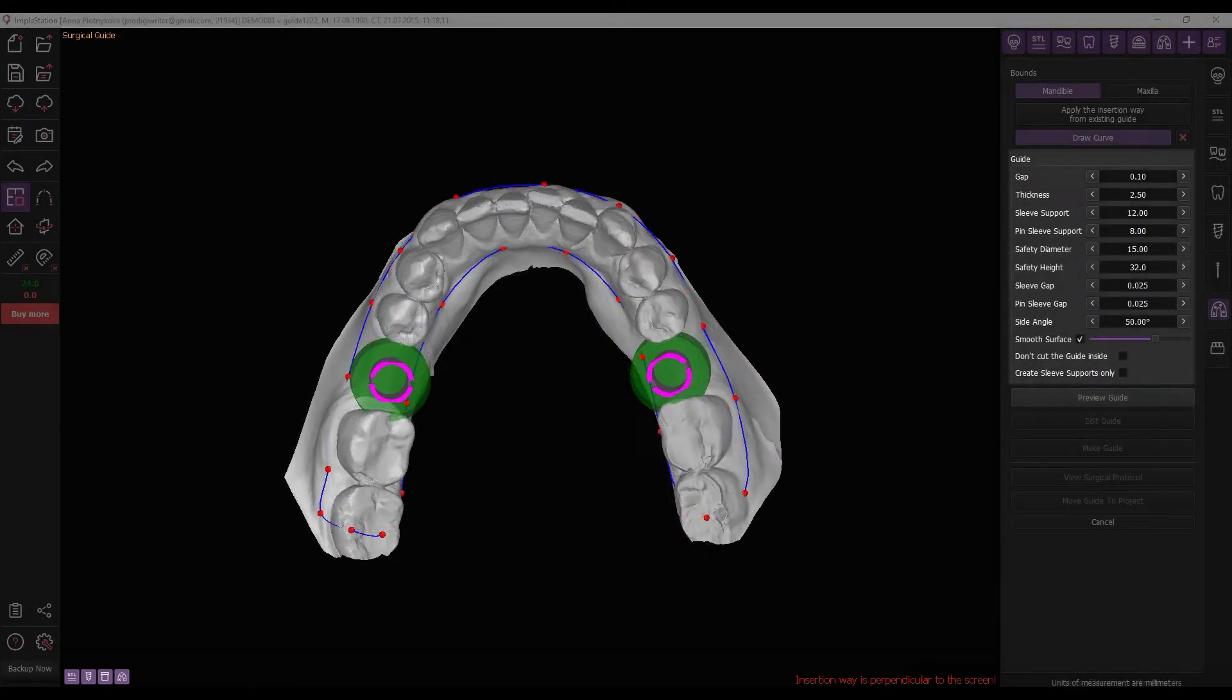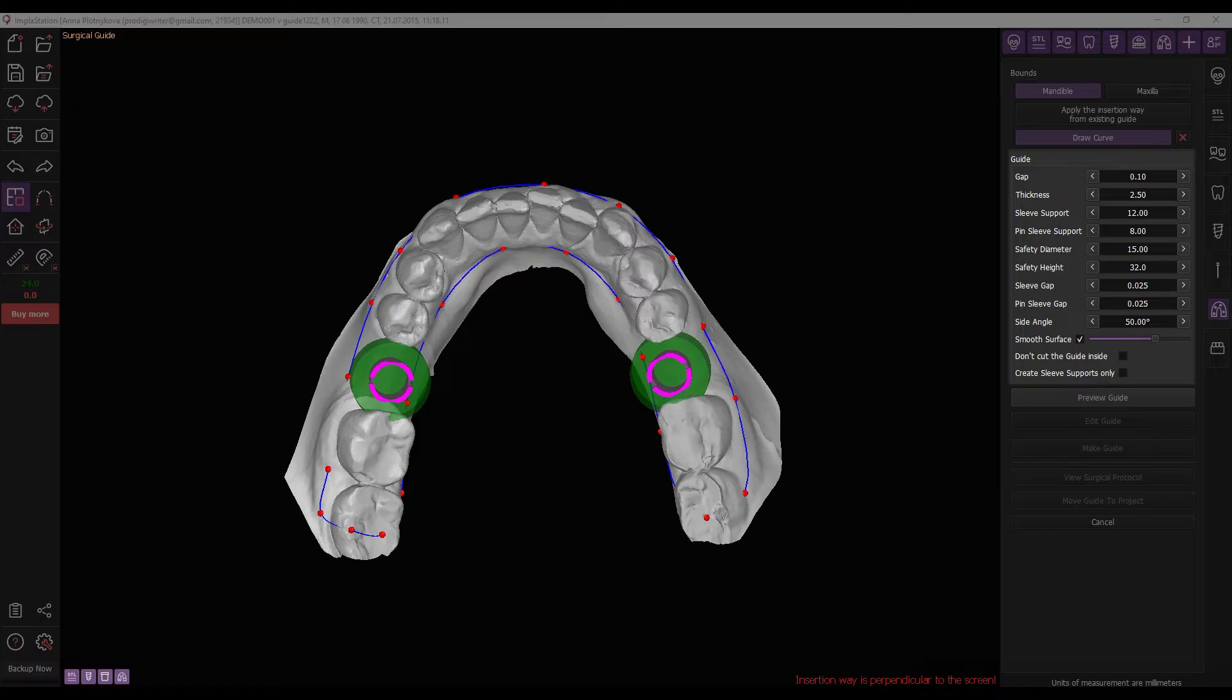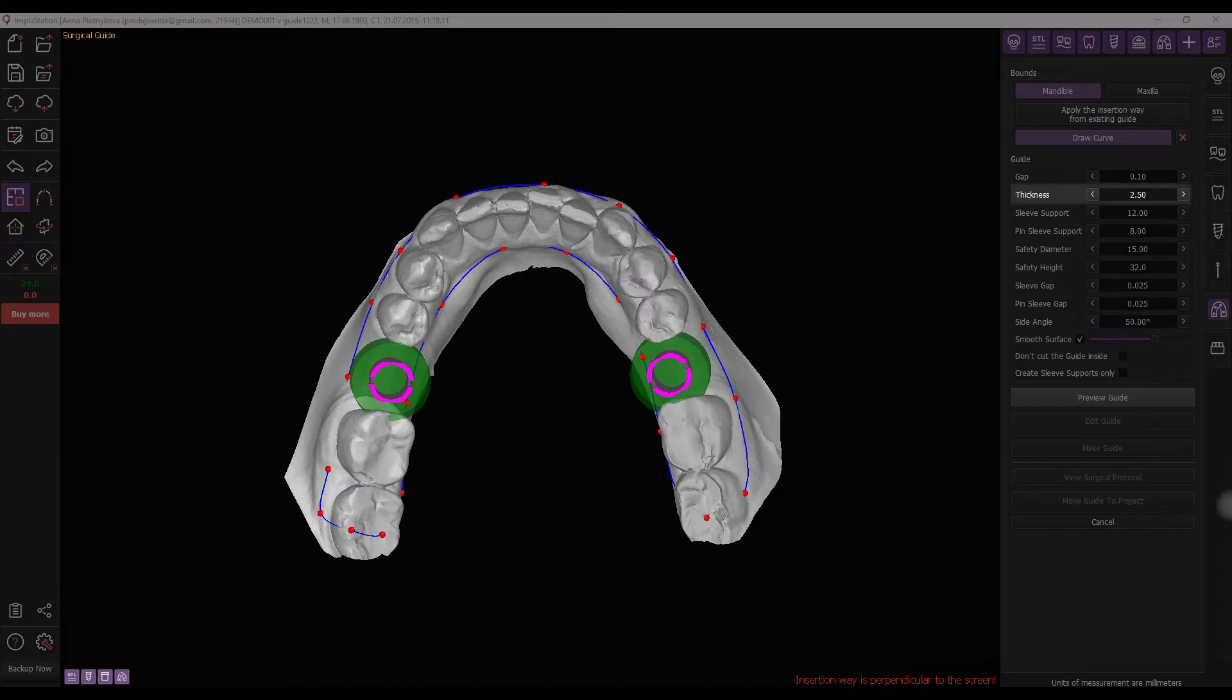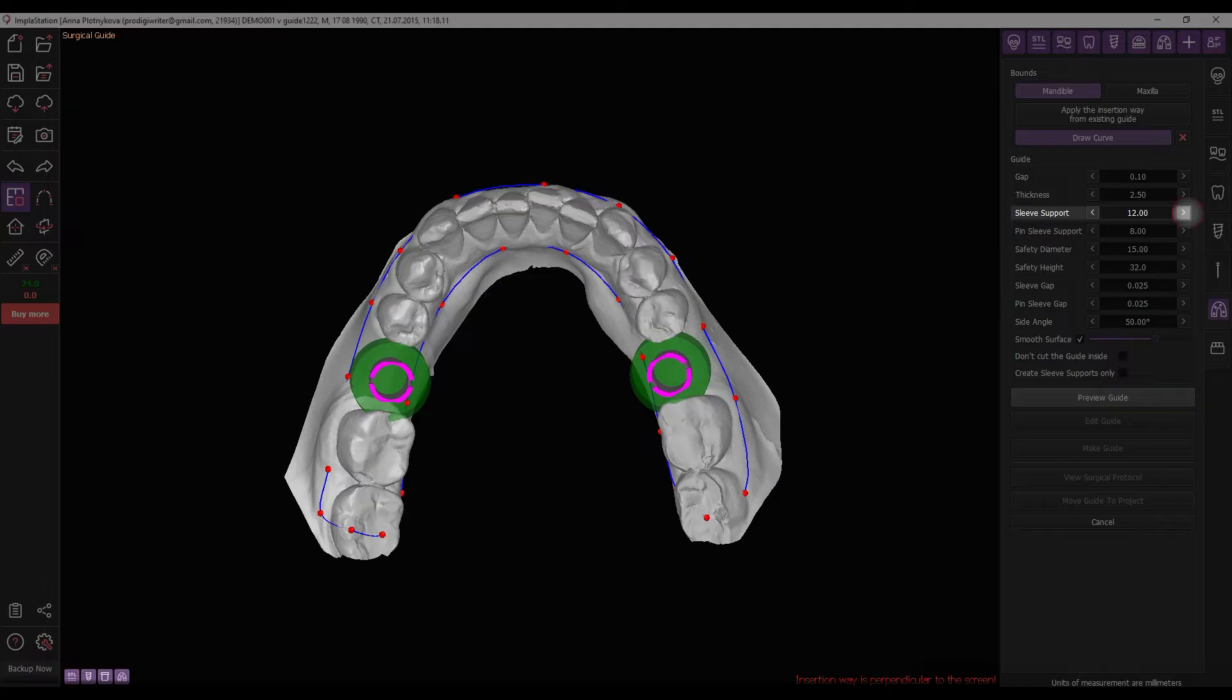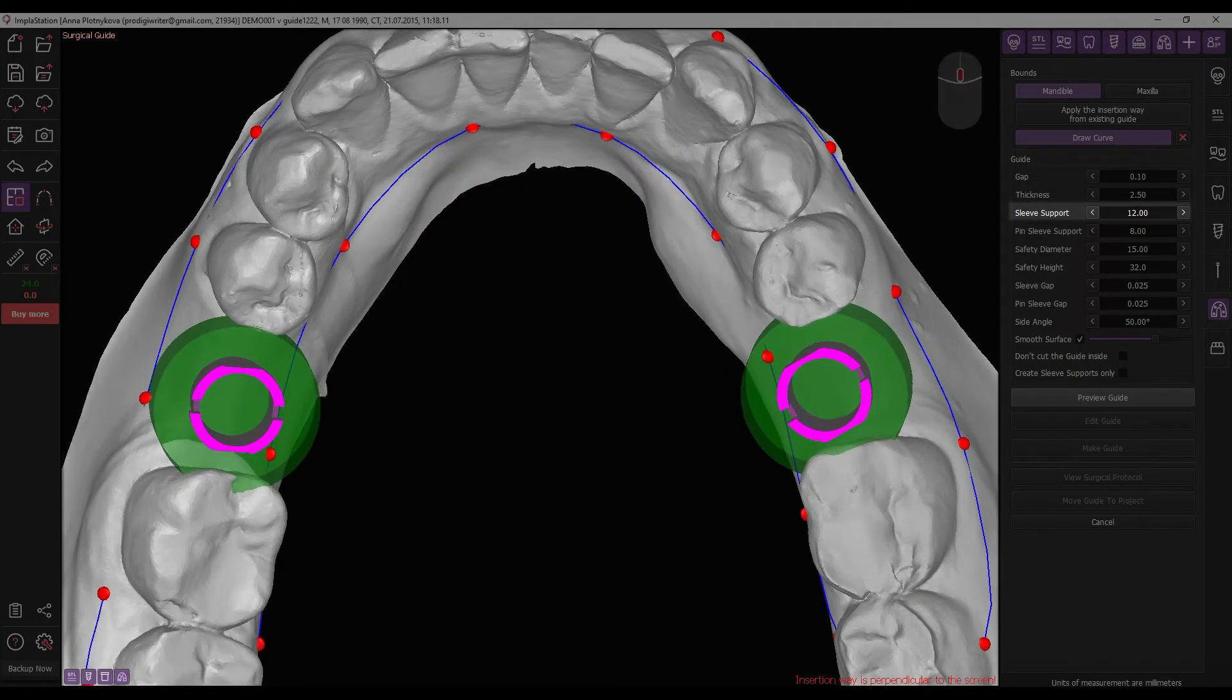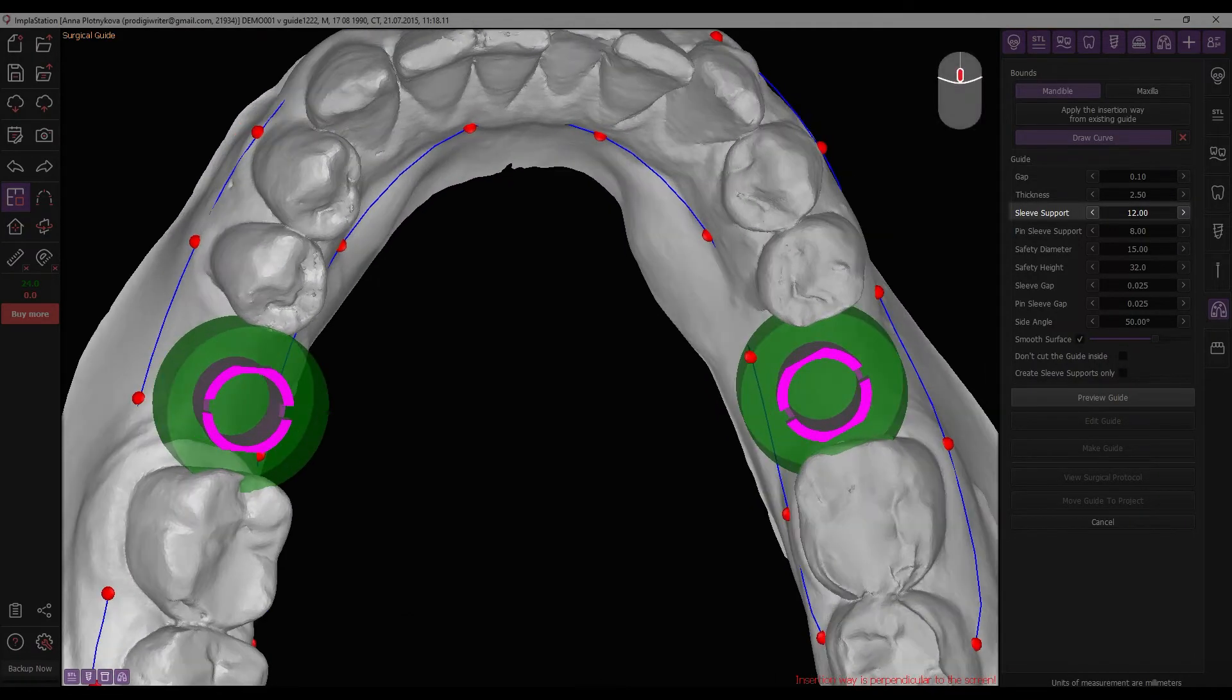Configure the settings for printing the surgical guide as follows. The gap between the surface and the guide. The surgical guide thickness. The diameter of the sleeve supports. You can modify this parameter for all sleeves by entering values digitally or manually adjusting the cursor on the sleeve and using the scroll wheel.